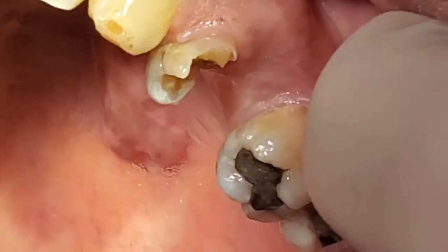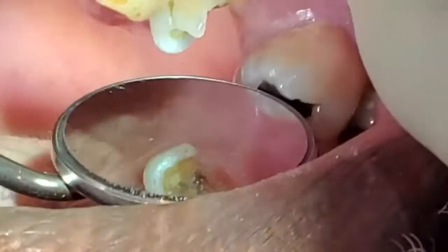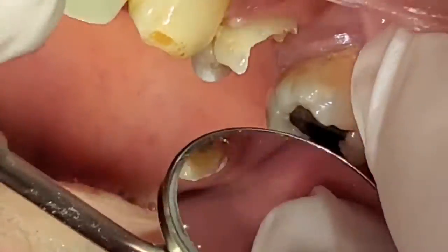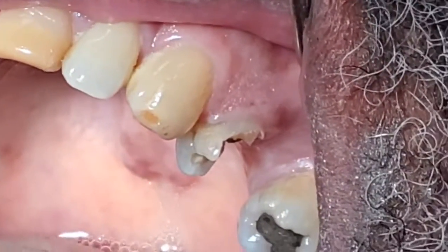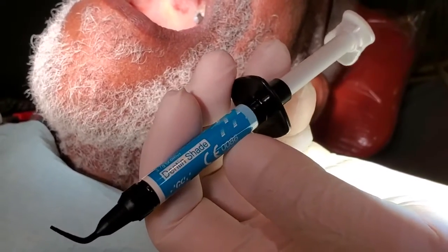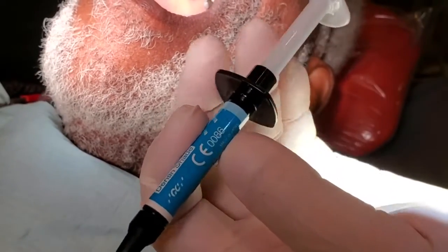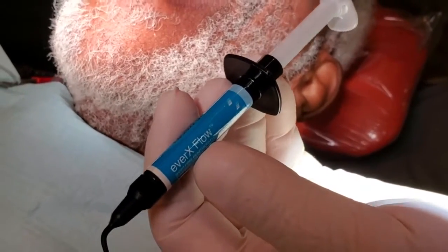We have a fractured tooth here today. We took out a large amalgam and you can see this fractured tooth. We're going to do a build-up today with a phenomenal material from GC called EverX Flow. EverX Flow is a fiber reinforced dentin replacement, and when placed into the tooth it flows but sits — this fiber reinforced material is extremely strong and when you cut on it, it cuts just like tooth structure.